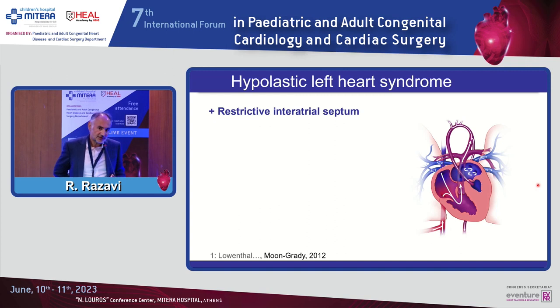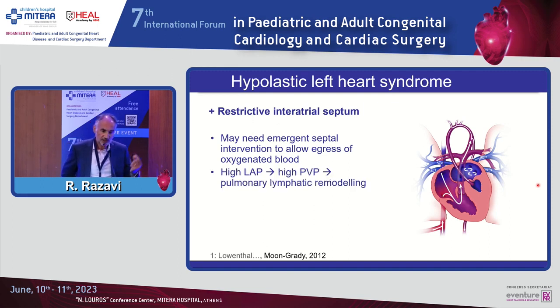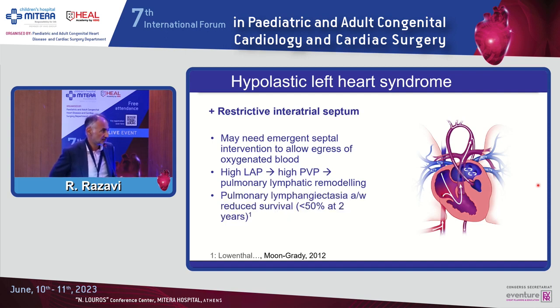Now, what are other indications for fetal cardiac MR? Well, one is hypoplastic left heart and restrictive atrial septum, and not so much for the anatomical views, but of course the key point here is that if there is a restrictive septum, and of course there are signs for that, including measuring the size of the foramen versus the whole complete size of the septum, you want to deliver and also intervene early in the child.